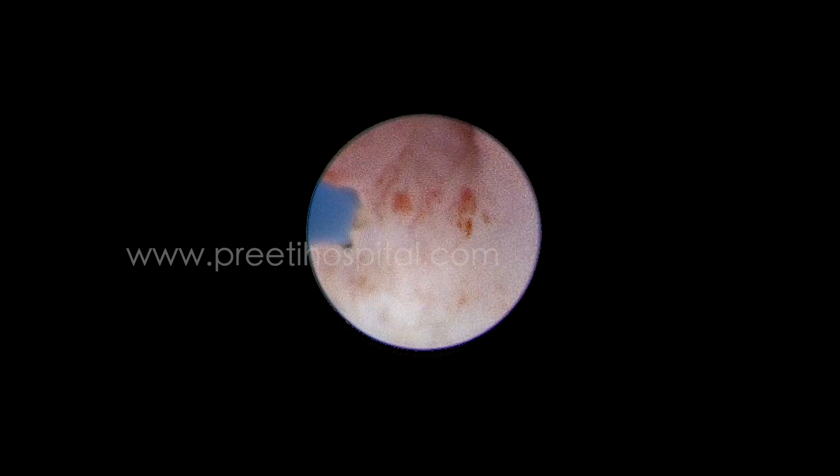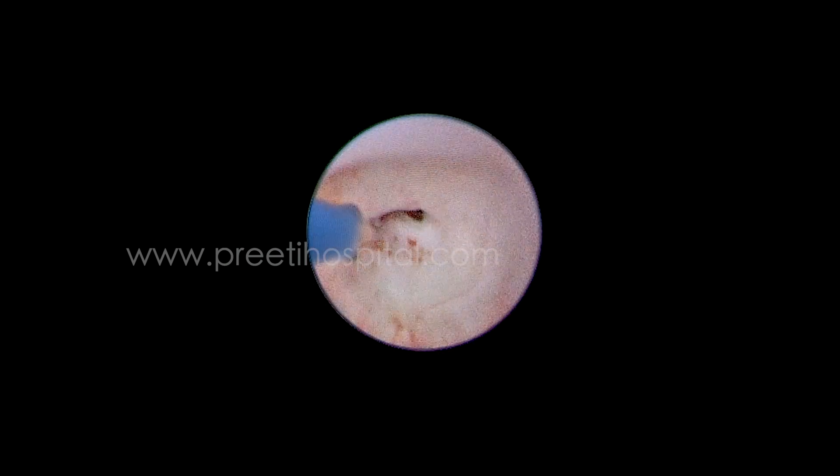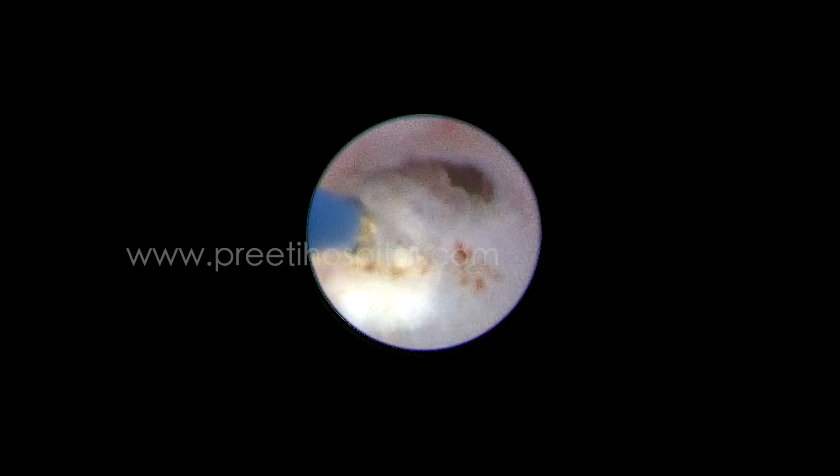Here you have to cross the veru. Even if you touch with the laser — see here — you cannot see the curtain. You should see this is a flap, and this flap continues anteriorly. Fulguration of the posterior surface has no meaning. See here, I am fulgurating at the level of 5 and 7 o'clock position.